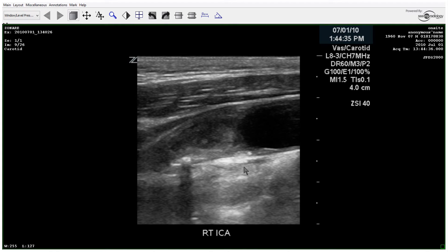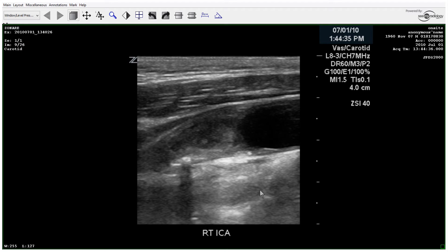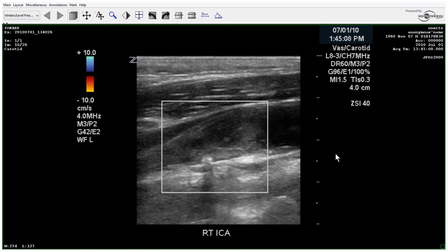There's your color Doppler that shows no flow in the ICA. This is a pretty dramatic image — you can see there's just nothing but a thrombus-filled lumen, pretty much from the beginning of the bulbous portion of the ICA and on through. We could turn down the overall gain here as well.